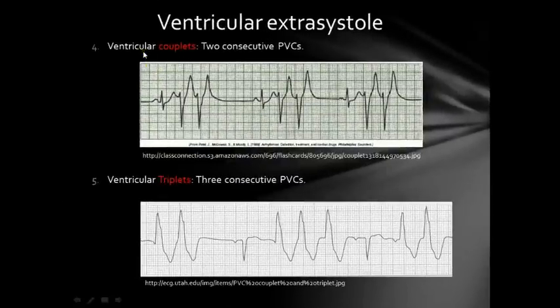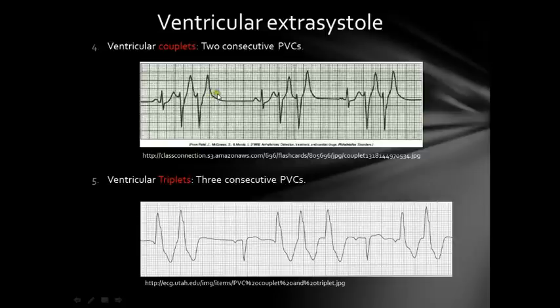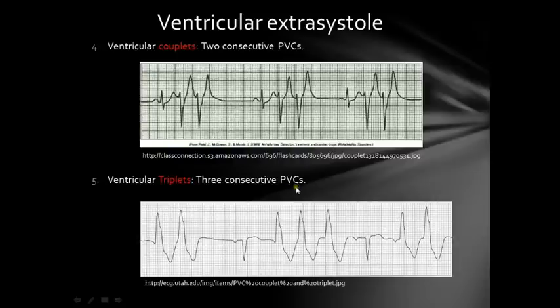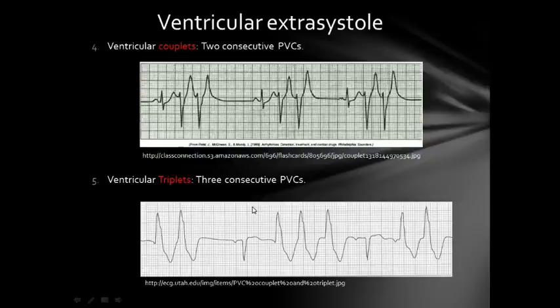The fourth type based on repetitive pattern is called ventricular couplets: two consecutive premature ventricular contractions. So a normal beat followed by two ventricular extrasystoles and then a pause, repeating. The fifth and last type is called ventricular triplets, where we have three consecutive premature ventricular contractions: one normal beat, three ventricular extrasystoles. If we have more than three consecutive premature ventricular contractions, we call it ventricular tachycardia.